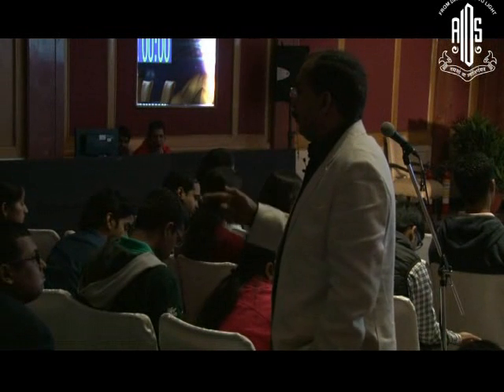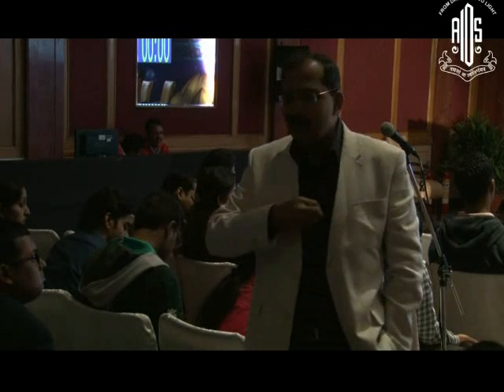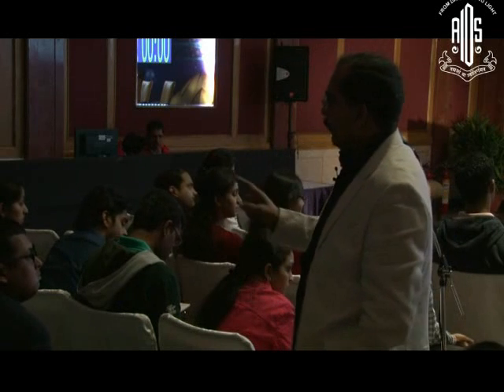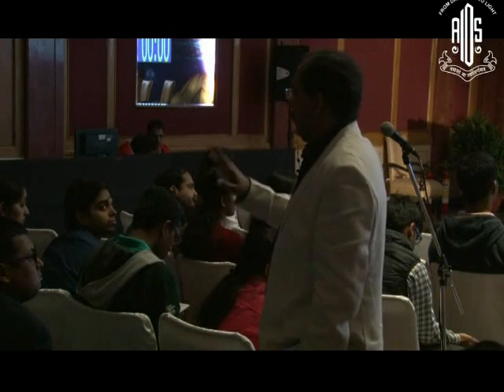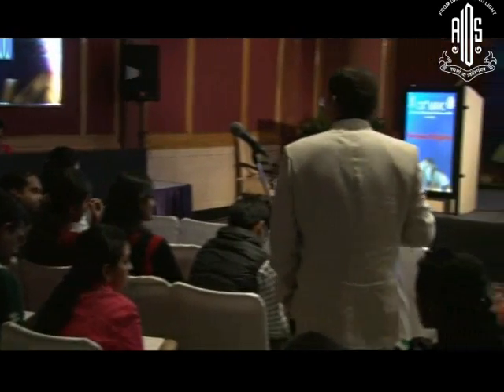So if the scotopic pupil is 4.5 millimeters, imagine, then you can go ahead and decrease the optic zone and do LASIK. If his scotopic pupil is 6.5, you can't do LASIK on him. You can't reduce the treatment zone. So what is important is total power. You have to see the corneal thickness, and how much correction your machine gives for so many microns of cornea. Then, what is the treatment zone and what is the scotopic pupil? These are the things you need to understand.